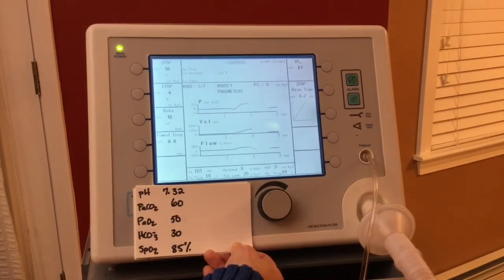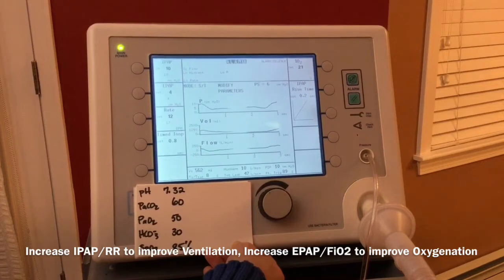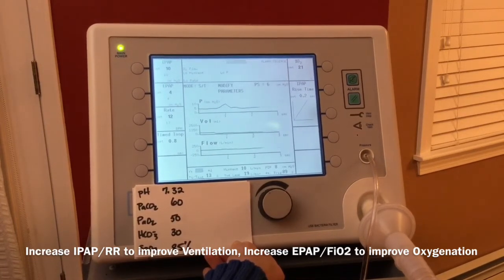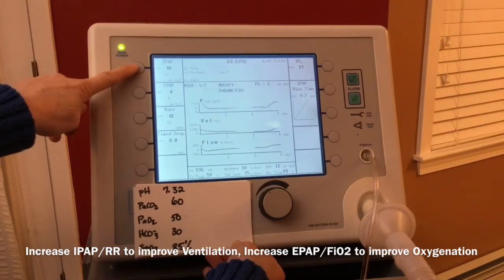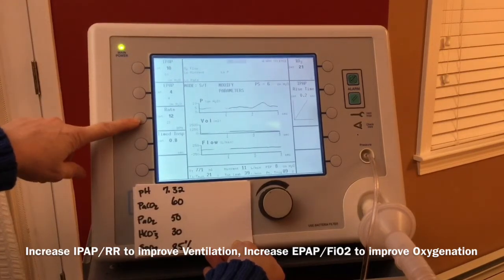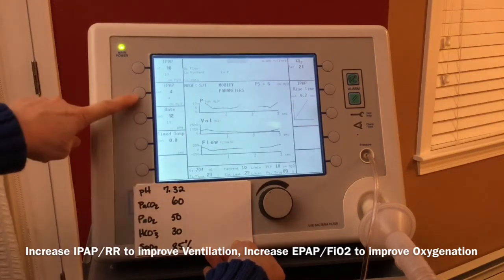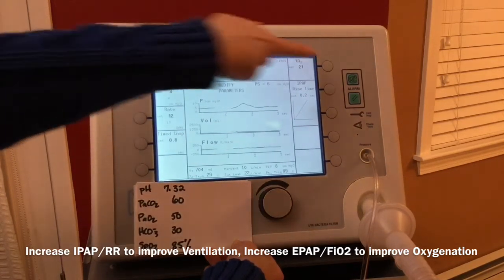What parameters would you change on the non-invasive ventilator to improve the blood gas? Pause the video. To improve the ventilatory defect, which is a high CO2, you could increase the IPAP or increase the respiratory rate. To improve the oxygenation status of the patient, you can increase the EPAP or the FiO2.